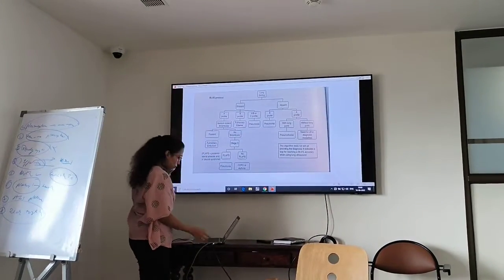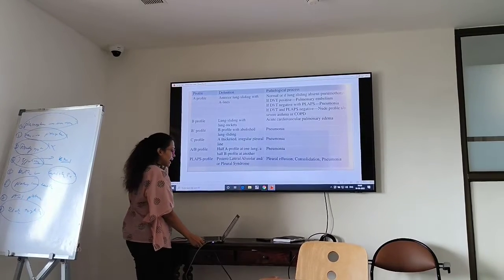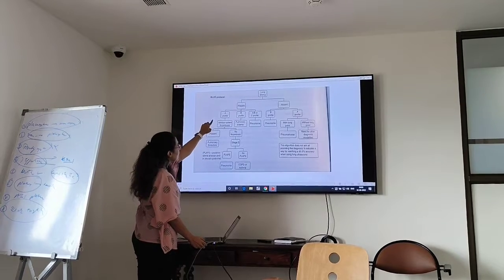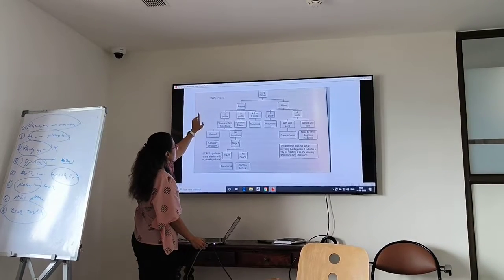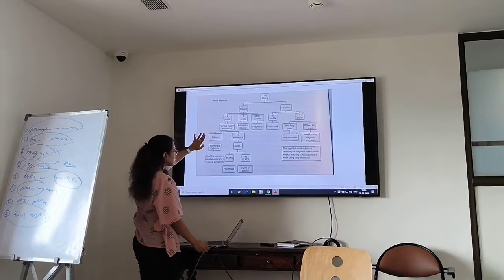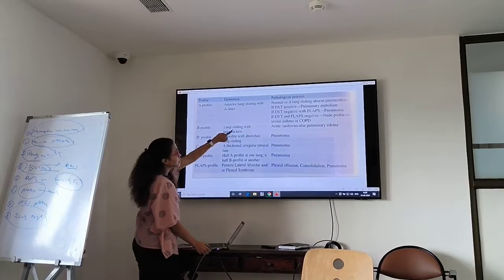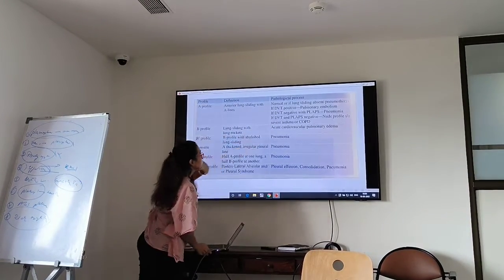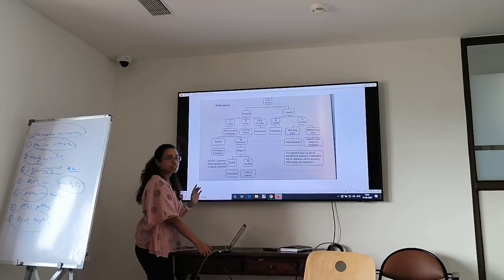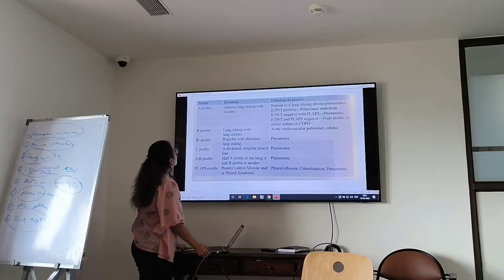So what was in A profile? We have lung sliding along with A lines. So if we have A lines, then we check for venous thrombosis, whether there is thrombosis or not. If thrombosis is present, that means we could be dealing with PE. That is what we had seen, if DVT is positive. So this is basically a tabular form of what I had shown previously. So go back to the A profile. You've understood this.